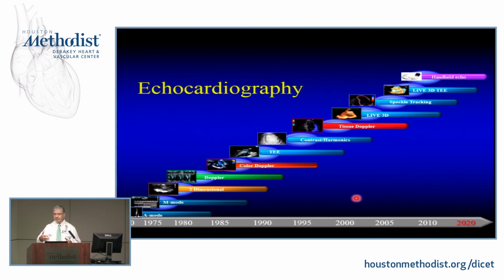And those are improving. Now it has some color Doppler, it doesn't have spectral, but ultimately will. And I would invite you to see the review that Dr. Shamsi Pasha put together. It's not yet accepted, but hopefully it will be in circulation a couple of months from now, telling you about the utilization of pocket ultrasound.